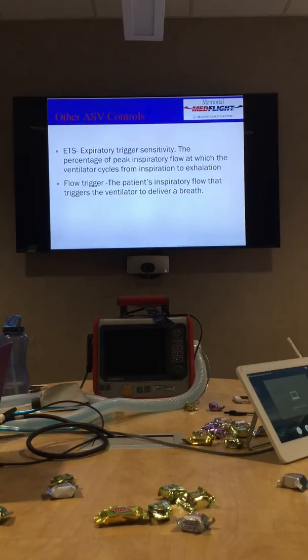We'll get a little more into what that is exactly, but I think it was defaulted at 30%, 40%. No, I should have looked. We have it, I think, at 30. I thought it was 25. It might be 25. That's right. Most vents are 25. 5 to 25 is typical.